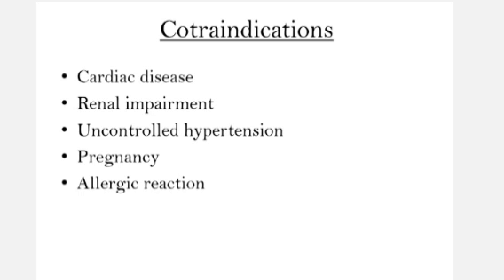Contraindications: in which conditions do we not suggest this test? In cardiac disease, in cardiac patients, we cannot suggest the FFA. Also renal impairment, uncontrolled hypertension, pregnancy and allergic reaction to the dye. In these conditions we cannot suggest the patient to do the FFA test.